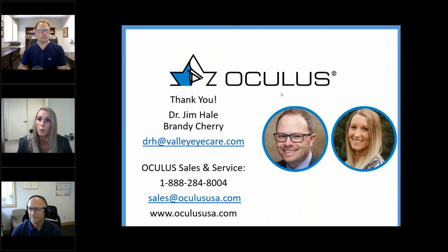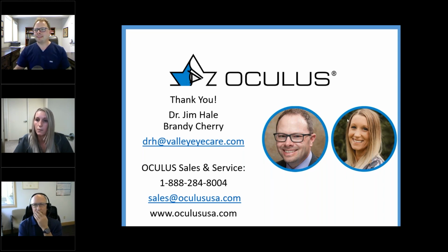Yes. I'm so used to knowing what it looks like because I do dry eye as well with the Oculus. You're going to want to get familiar with the technology, and Dr. Hale, I don't know if you took a picture of what it looks like before you even start the test. You're going to want to enter the patient before you even take the patient back there. You're going to want to clean everything off. You're going to want to have the trial lenses ready and laid out so you can easily put those in. So you're going to want to think ahead: what do I need to make this faster?